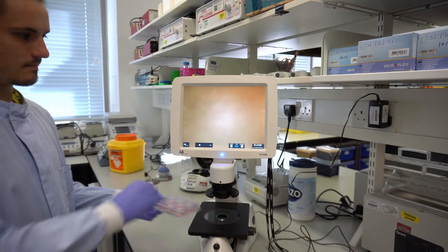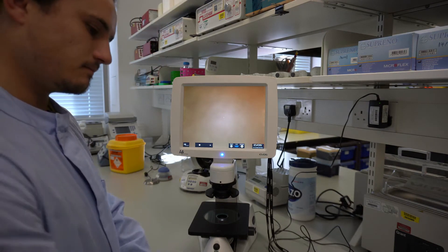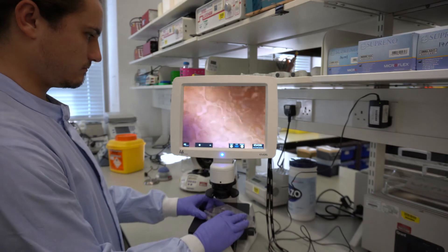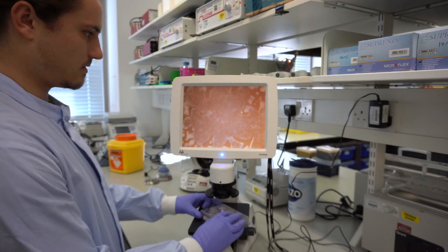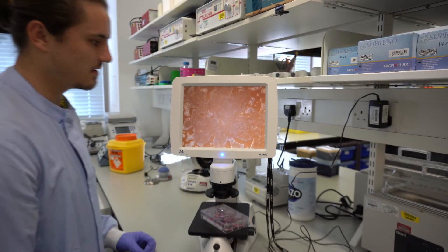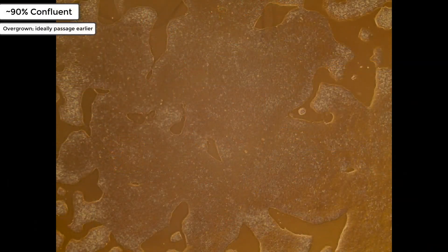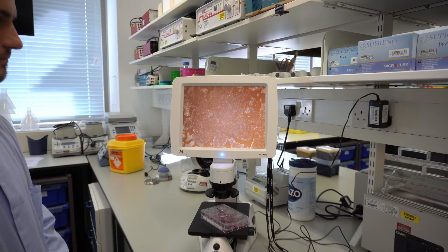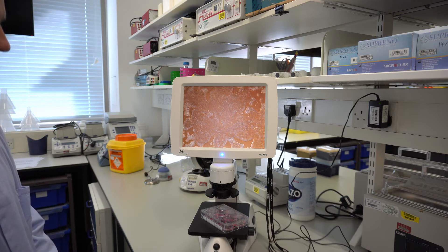Next, he's going to demonstrate a well that's approximately 90% confluence — so slightly overgrown. Here we have a perfect example: it covers the entire screen, everything's merged and squashed together. If this view were representative of the entire well, ideally you would have passaged these cells on an earlier day. But if that's not possible, you'd want to take the confluence into account when splitting, because growth may have slowed as the cells all grouped together.